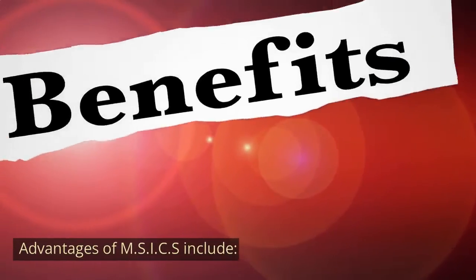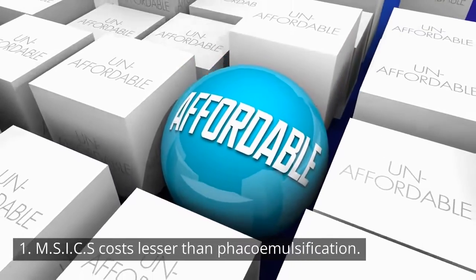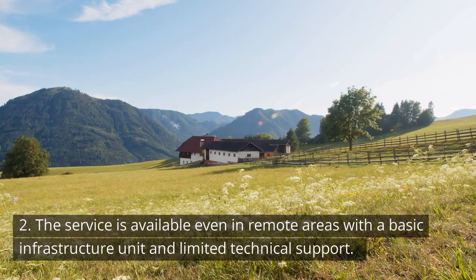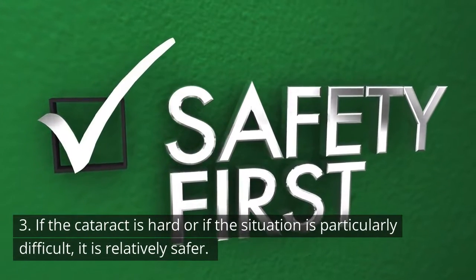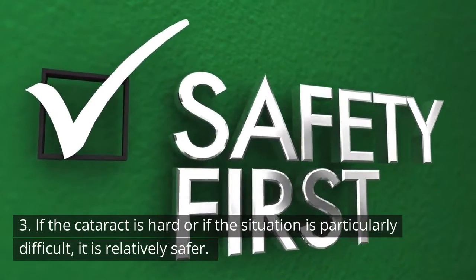Advantages of MSICS include: 1. MSICS costs less than phaco emulsification. 2. The service is available even in remote areas with a basic infrastructure unit and limited technical support. 3. If the cataract is hard or if the situation is particularly difficult, it is relatively safer.